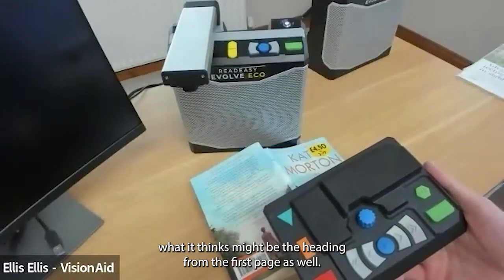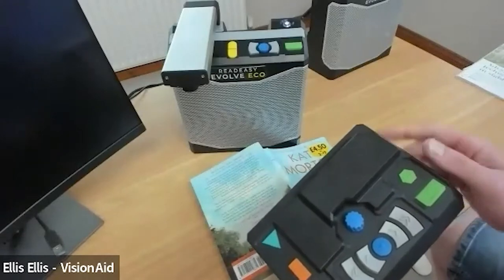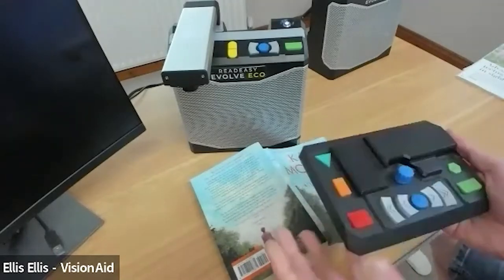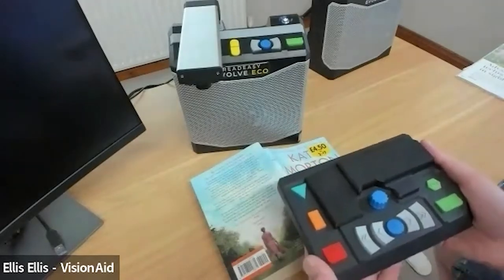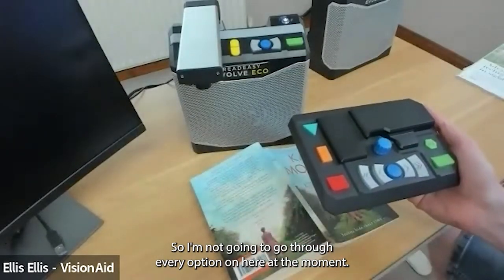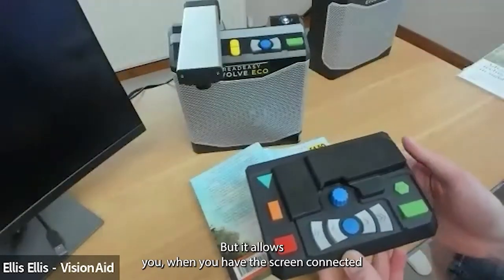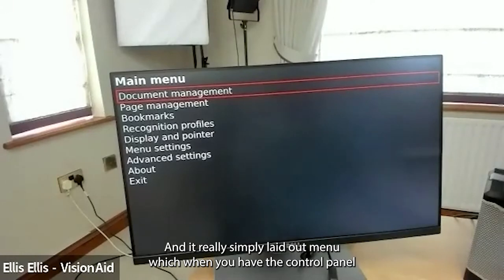The orange rectangular menu button with three tactile lines gives access to document management. Quick-pressing it enters document management where you can store documents with voice tags in the machine's memory. It will automatically name the document based on what it thinks the heading is from the first page. You can save, load, and import/export documents in various formats via a USB memory stick — the Evolve Max supports slightly more formats. Now I'll connect the Evolve Eco to a screen to show the more advanced features.